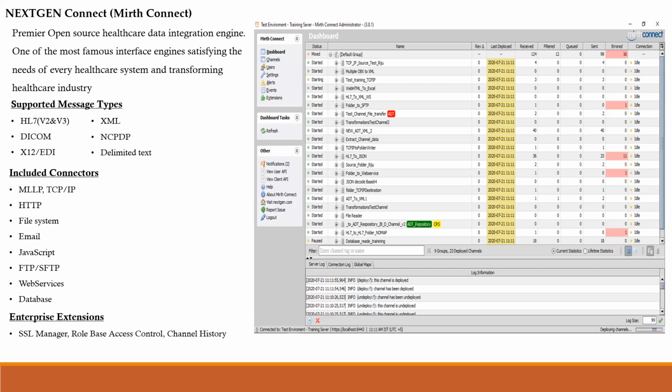That being said, it's an organization, right? So there are a few premium aspects of Mirth Connect which are not present in the free open source software. They have a few license plans called silver, gold, and platinum. Those license plans are for getting support from Mirth Connect. They are not for the product. You can use the product if you want to, and as long as you can manage your solutions within the free open source product, you are good to go.